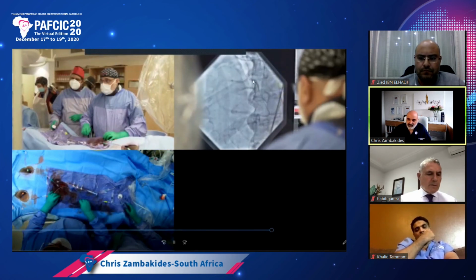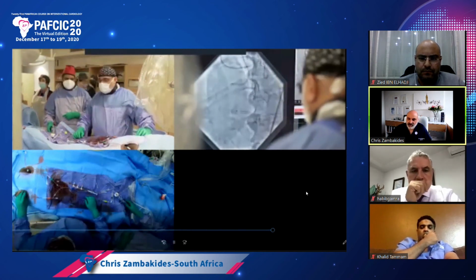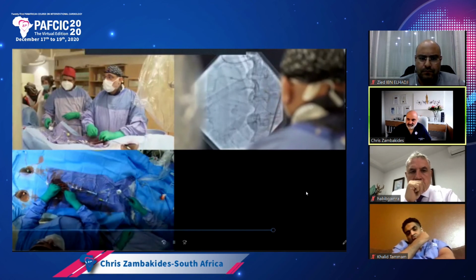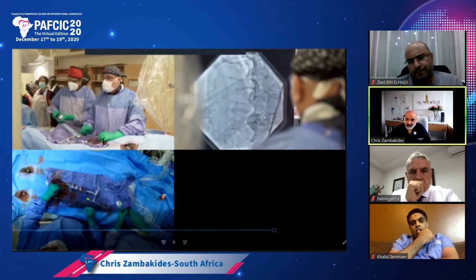We trapped the wire with the balloon up, so what we can do is see if this goes easily in the catheter. That way we were able to advance our microcatheter much quicker, as you're going to see now. Take the balloon forward that we've got. You can see there. Right, now trap it.